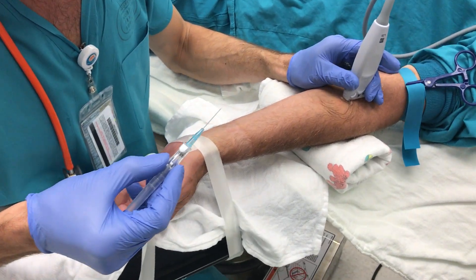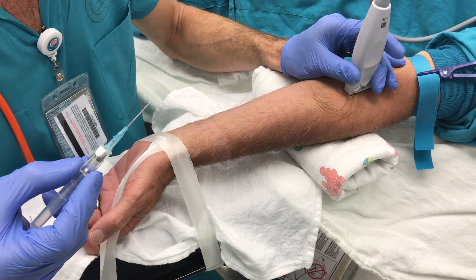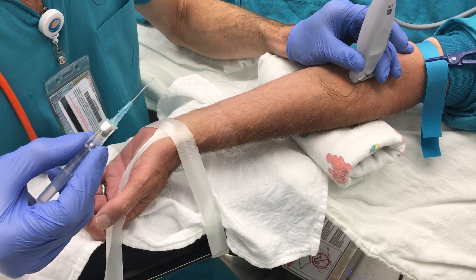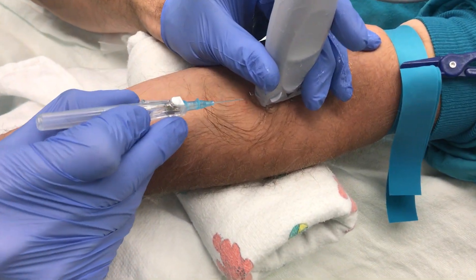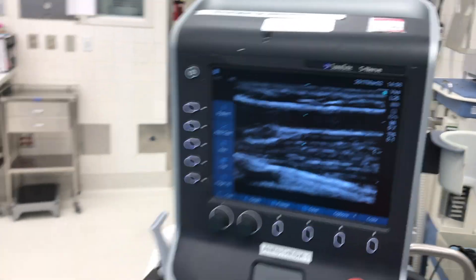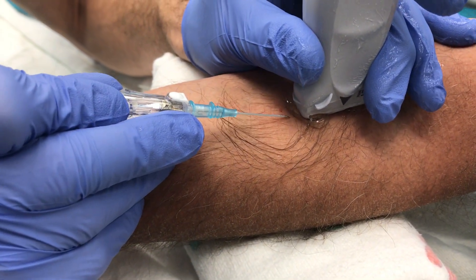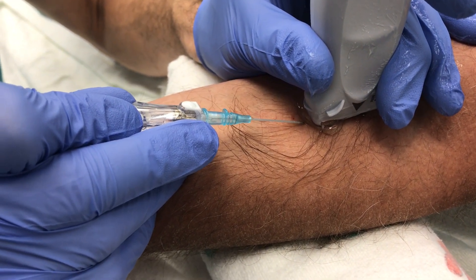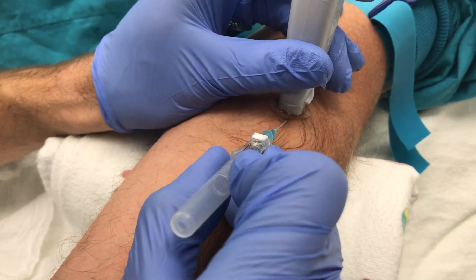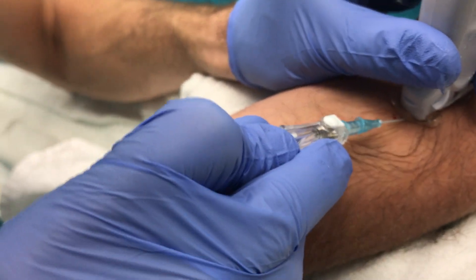You can see I'm holding the probe really low, with my little finger anchored on the skin, so the probe is just lightly hovering over the skin, not putting any pressure. When I'm going to insert the needle, I'm not looking at the screen. I get my image of the vessel on the screen first, and then when I'm confident I have that, I'm just looking at the probe and the needle, inserting the needle directly parallel in the center of the probe and going to put it underneath the probe.